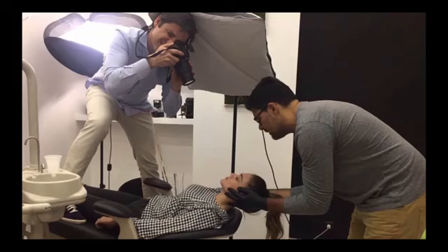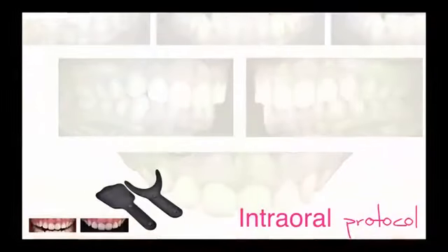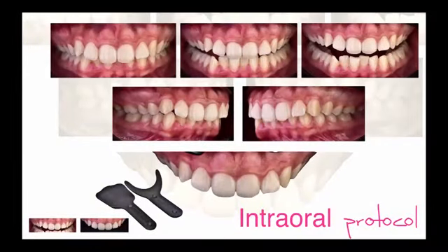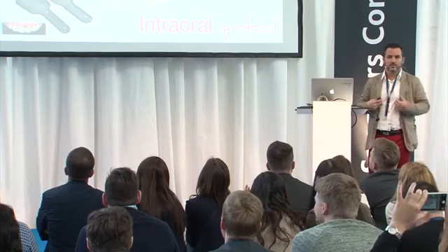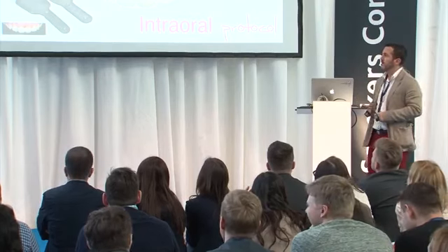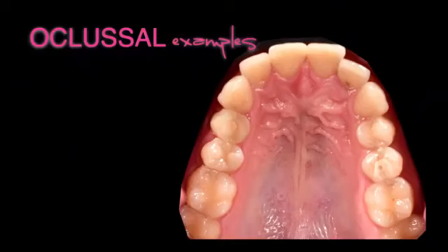These are good friends of mine from Spain, Federico and Borja Diaz. So this is another way to do dental photography, but I think it's more dangerous. So for intraoral protocol, I'm usually having this set of photos. Usually I ask this of my dentist, and for me as a technician it's enough to have an idea about what's going on there. And then we have some occlusal examples that I took today with the mirrors.